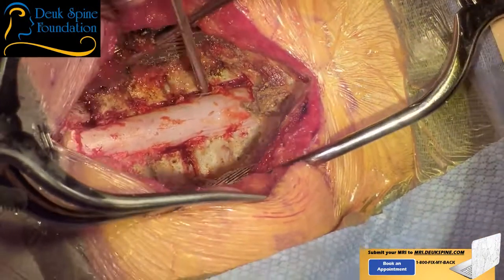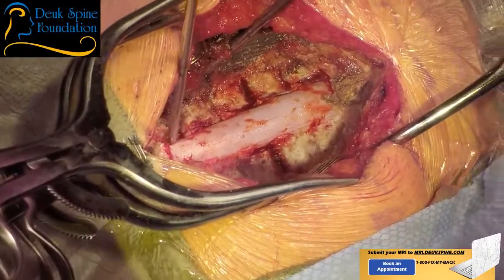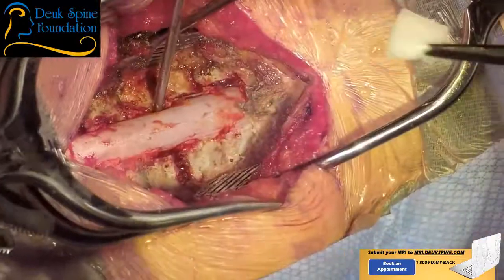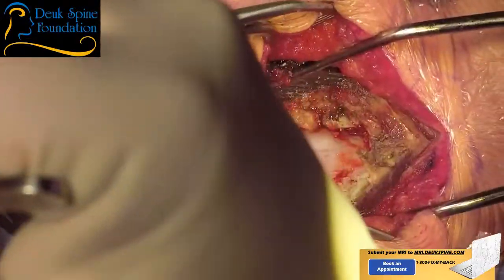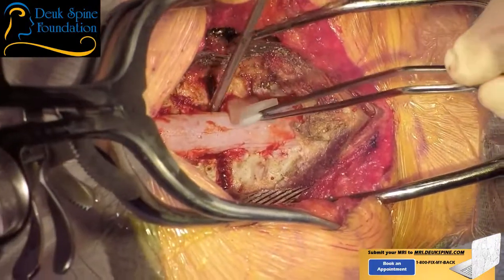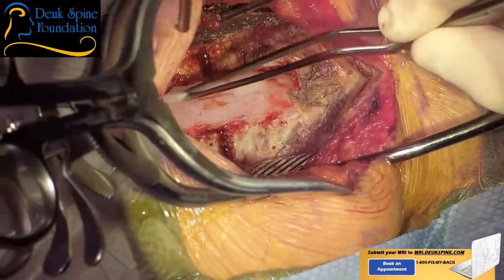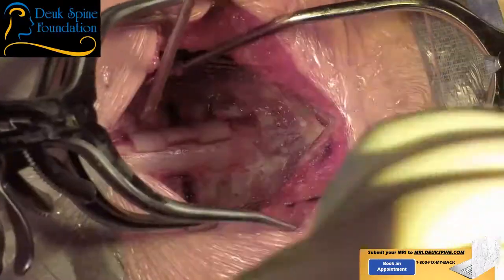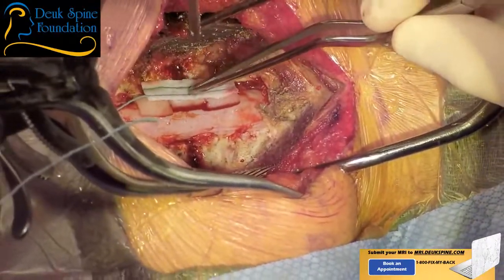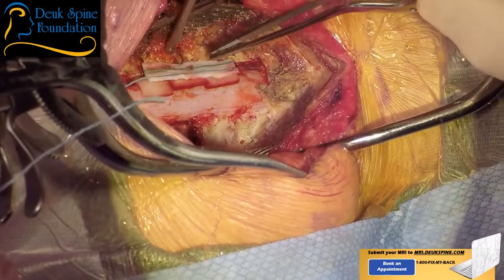All right, so let's just put some gel foam on there. Gel foam, thrombin. We got a little epidural bleeding, not much. Don't push down on it. Suck it one more time so we can get the clot off. Remember, you can't put your gel foam and thrombin on top of a blood clot. It doesn't work. It has to sit on top of the bleeding vein or artery. I see a lot of surgeons make that mistake. Push here, just gently, gently, gently. Good. Suck here. Good. Looks perfect.